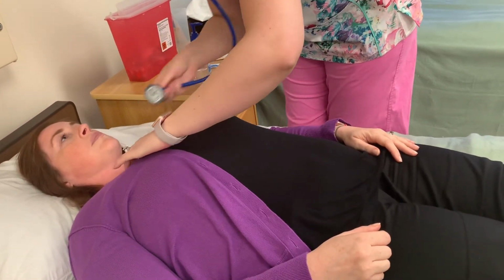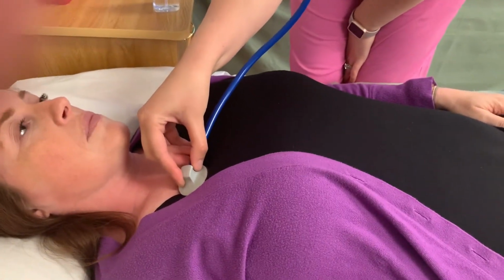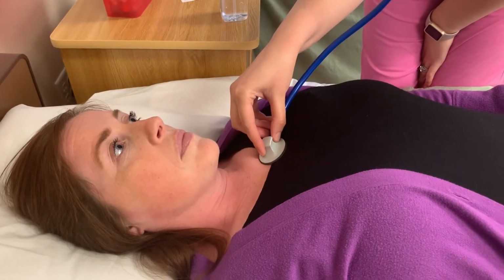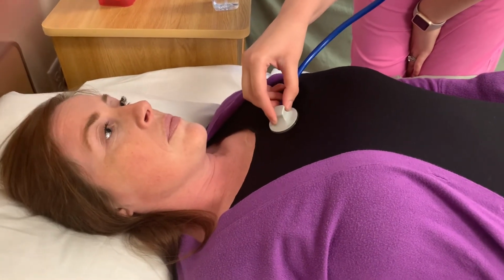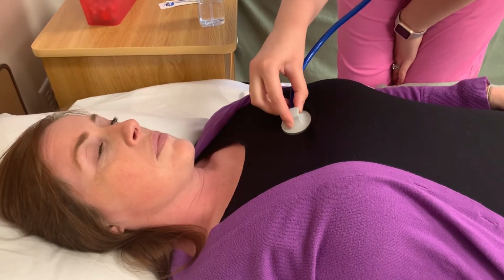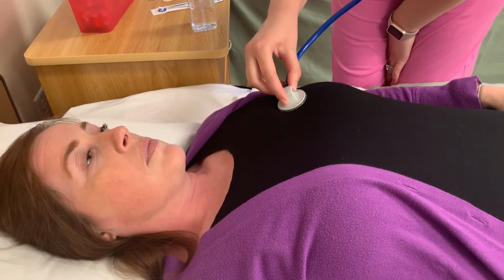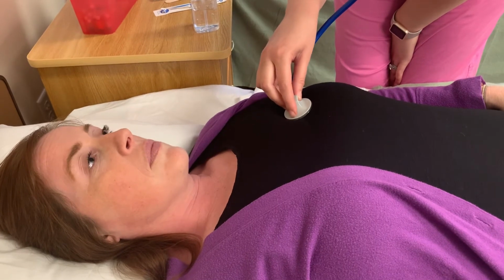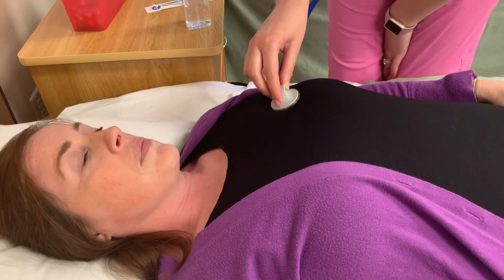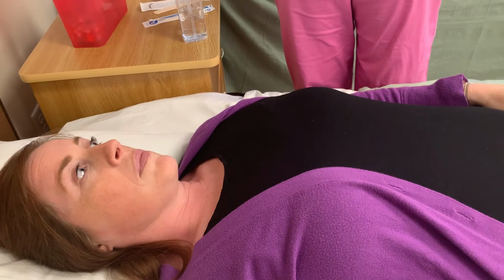I'm going to work my way down to the second intercostal space on the right side, listening to the aortic. Moving over to the pulmonic. Moving down one intercostal space to the Erb's point. Moving down to tricuspid. And finally, fifth intercostal space, mid-clavicular, I'm listening to the mitral. I'm auscultating and hearing S1, S2 sounds, so I am done with my cardiac assessment.